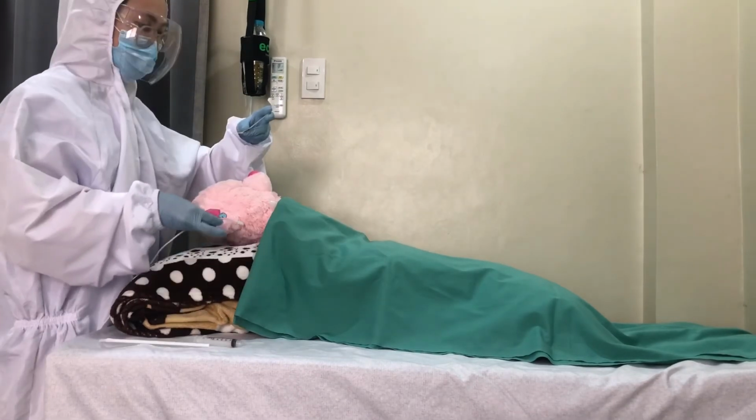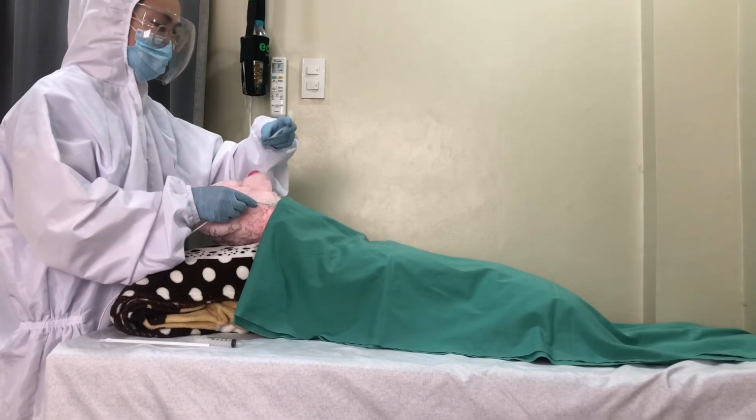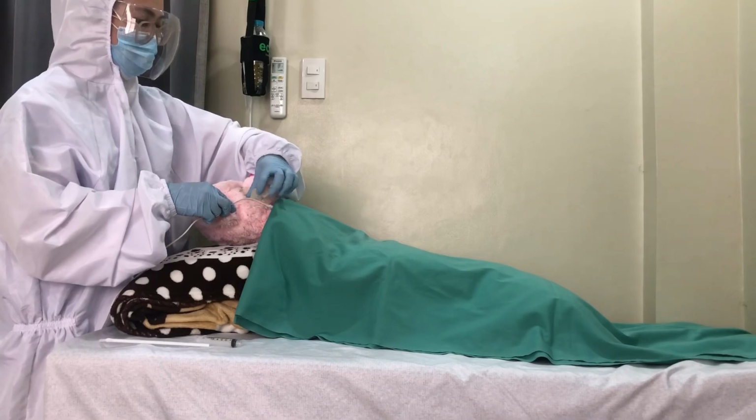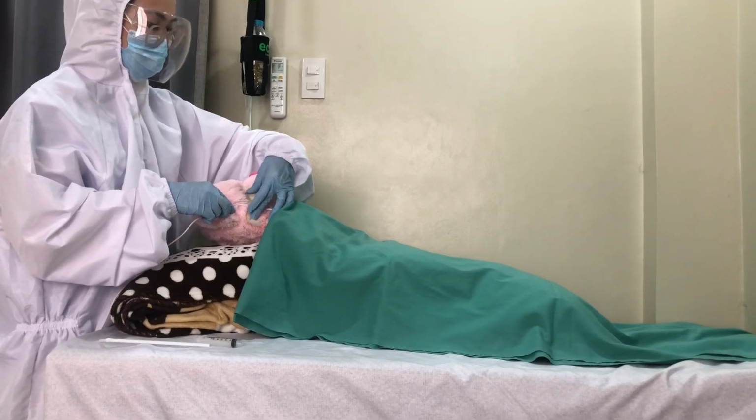If upon auscultation there are equal breath sounds, connect the tube to a mechanical ventilator and plaster the tube to the side of the mouth to keep it in place. And we now have our intubated patient.